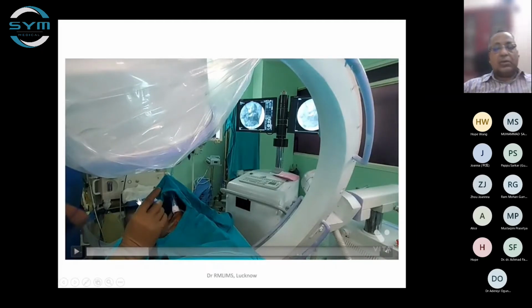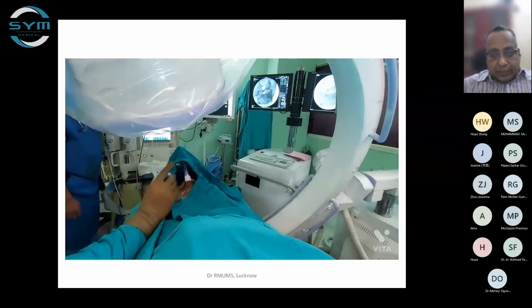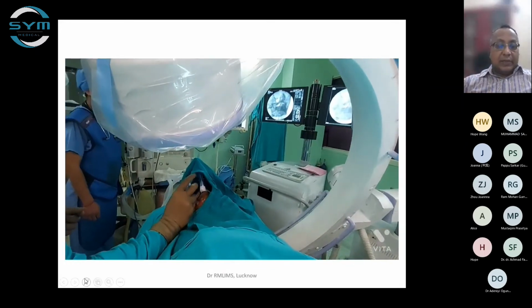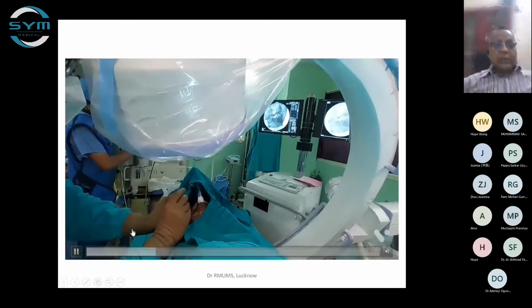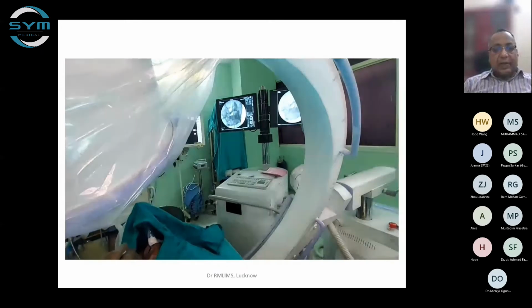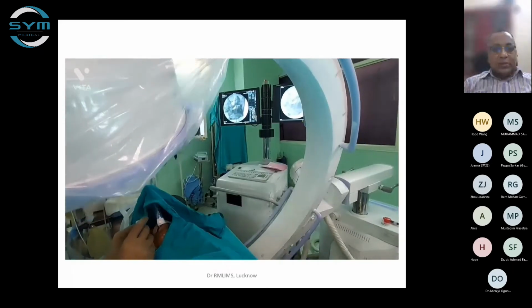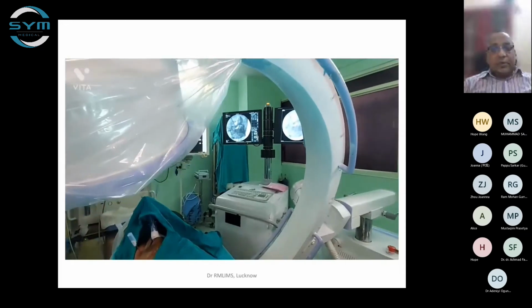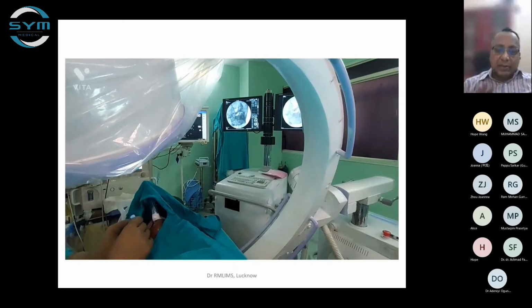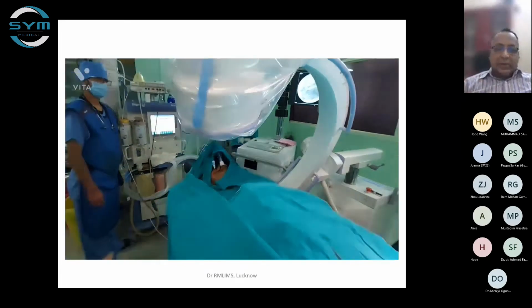I'm sorry, I've just come to know that you are not getting my sound which is there in the video, so I'll explain it. Now we have located the foramen ovale after making the submental vertex view, and we are trying to target the foramen ovale in a gun barrel view under the fluoroscopy, or coaxial view. We are trying tenderly to reach the foramen ovale first. Here it is important to reach only the foramen ovale and not advance too much into Meckel's cave with your needle. So you just stay at the gate of Meckel's cave, that is the foramen ovale.